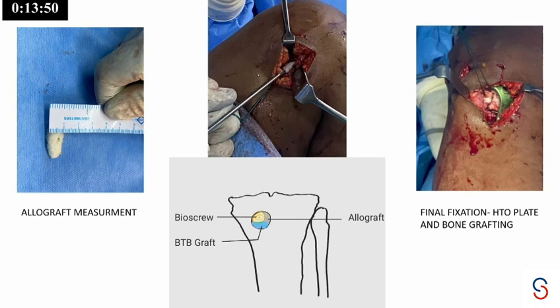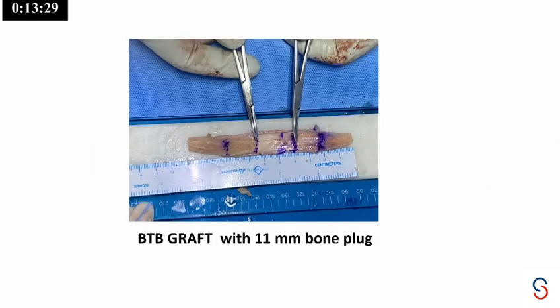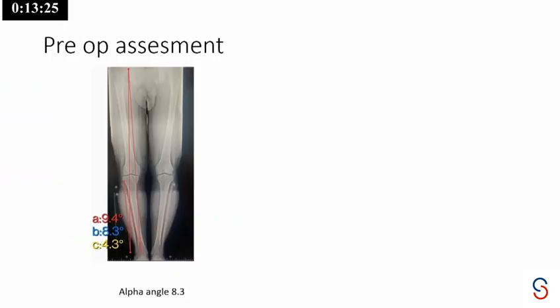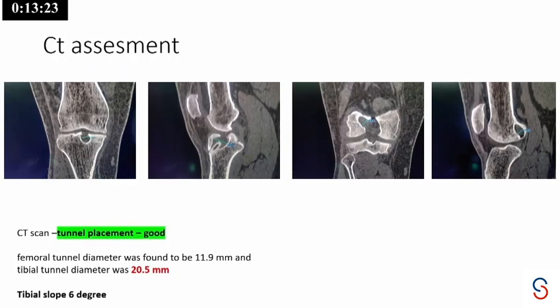Biocomposite screw. Okay. And Chirag, is your osteotomy uniplanar or biplanar? It's a biplanar. Biplanar osteotomy along with the tunnel is sometimes very difficult because your biplanar comes in. But you see here, my osteotomy level is much lower than that, and my tunnel is just posterior. If you see the preoperative imaging also, I have enough space to go ahead with my biplanar osteotomy. I'll just put up the MRI. Here is the tunnel, and the tubercle is here.